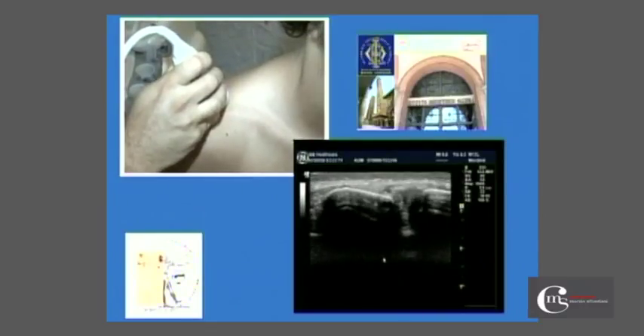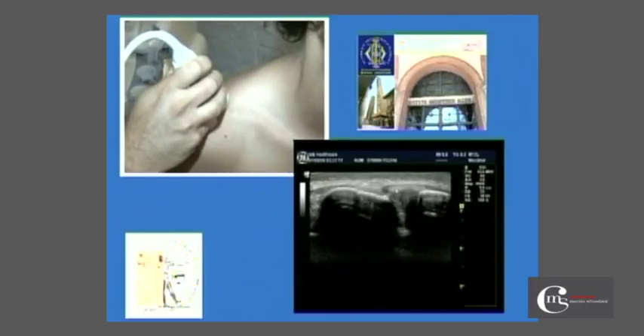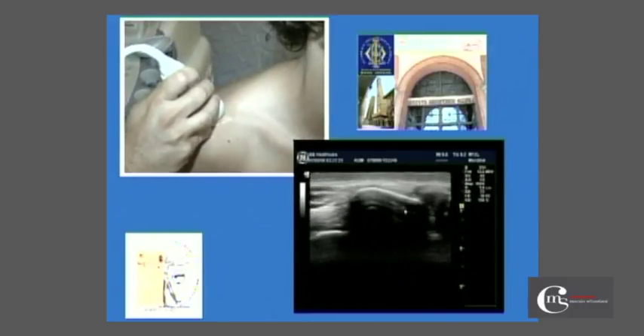We position the probe and show the acromioclavicular joint with its capsular insertions on the side of the clavicle and on the side of the acromion. We can see the joint space with the fibrocartilaginous tissue.